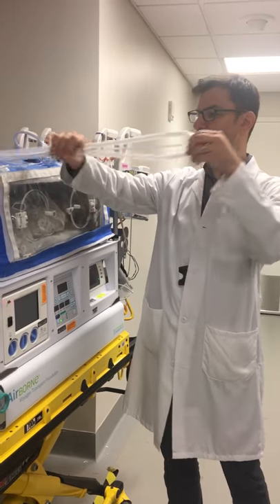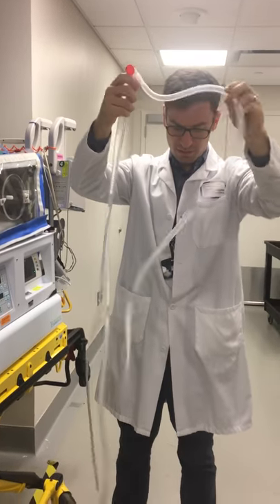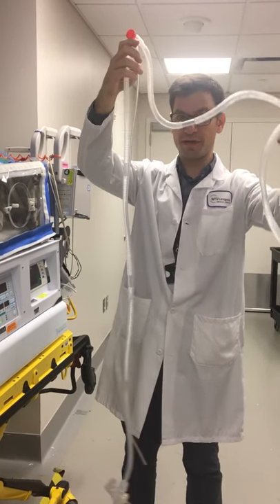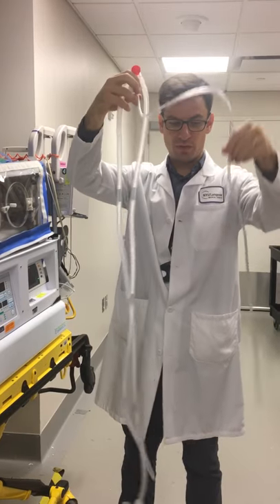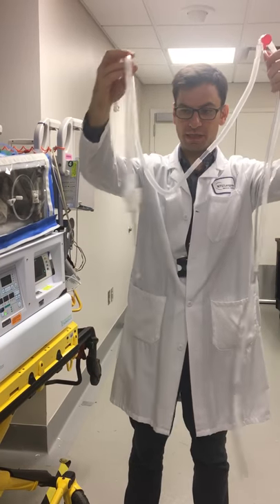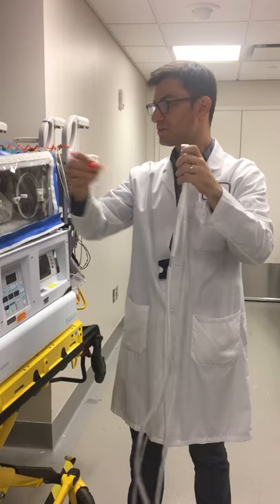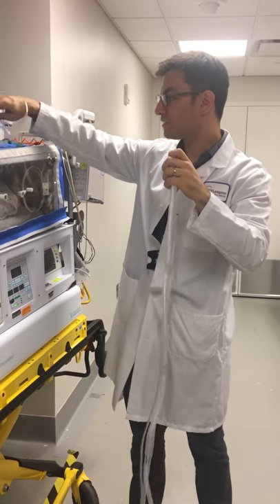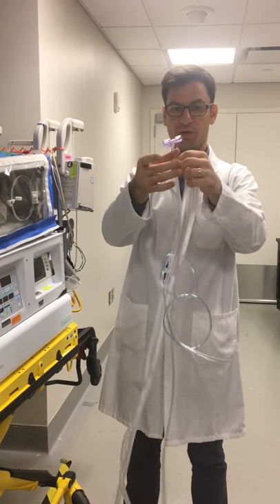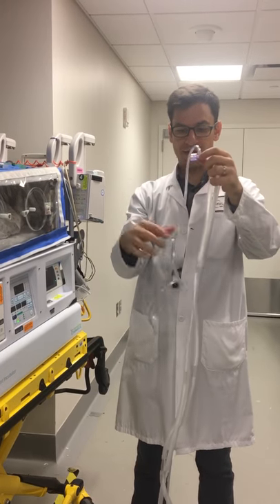This is our circuit that we use. It has the inspiratory limb right here, the pressure line right here, and our expiratory limb like this. We also use a flow sensor — our flow sensor looks like this right here, a little purple flow sensor, and we connect it right here.